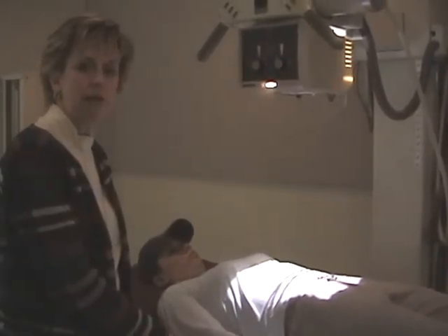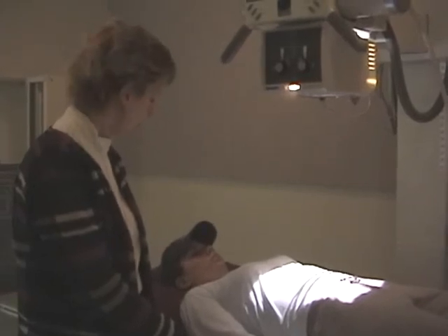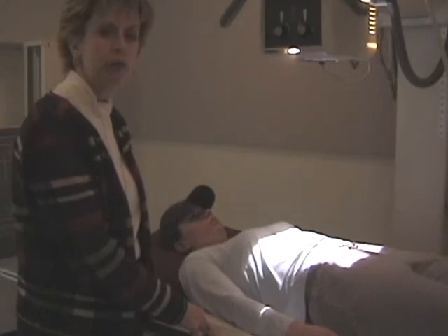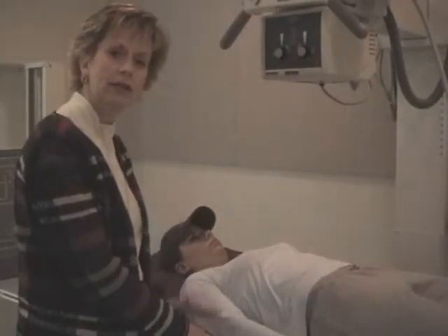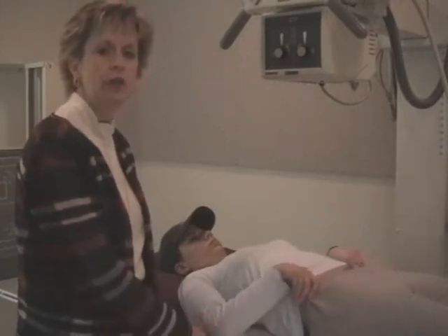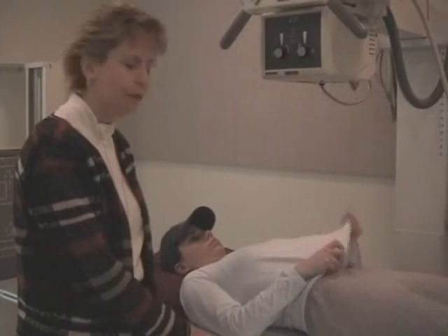To elevate the diaphragms, you have your patient take in a big breath, blow your breath out, don't breathe or don't move. So that's suspended expiration. We want the diaphragm raised. When you're looking at the x-rays, you should pay attention to the level of the diaphragms.